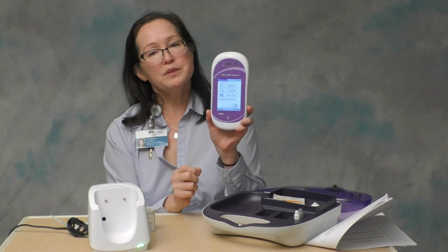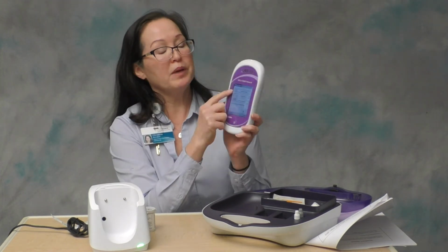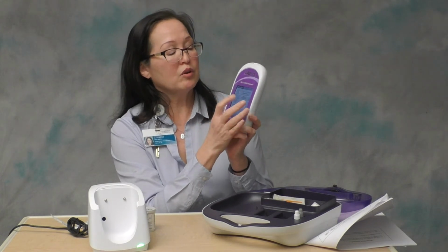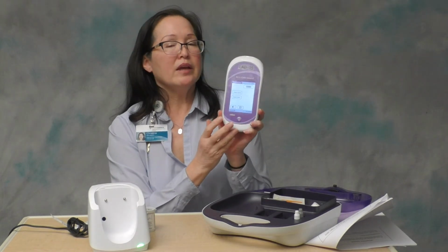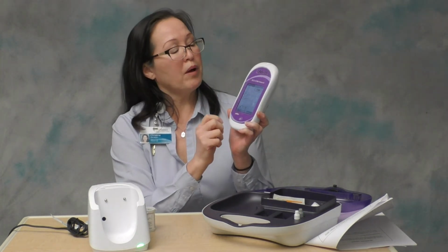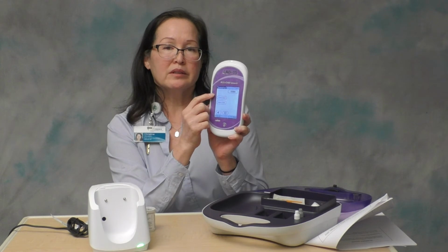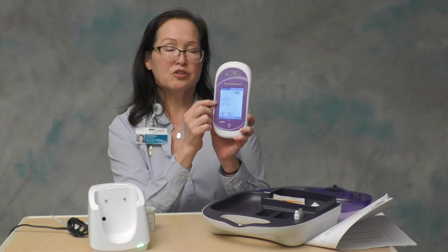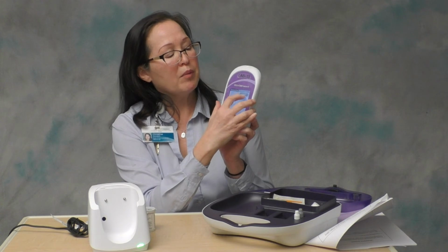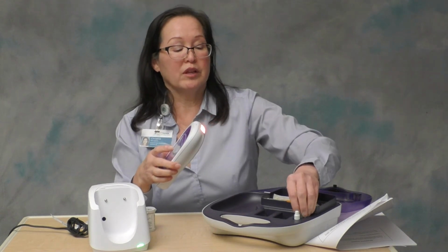The main menu pops up and you'll have access to patient test, control test, or review results. We're going to hit the control test button, and then it's going to take you to control test. It wants us to scan the control bottle. You don't need to select level 1 or level 2. These buttons are just telling you that these both need to be run right now. When you scan the bottle, it's going to know if it's level 1 or level 2. So I'm going to scan the level 1.